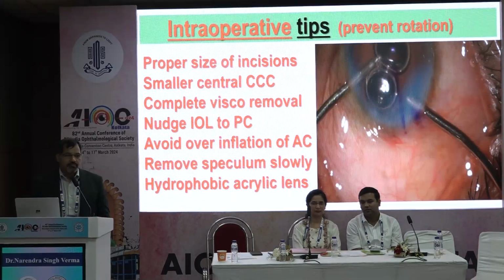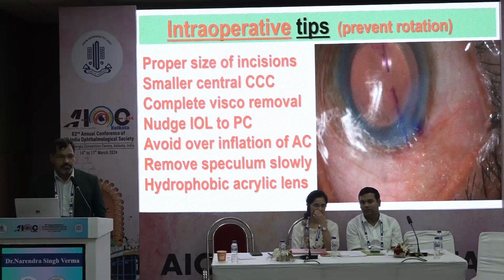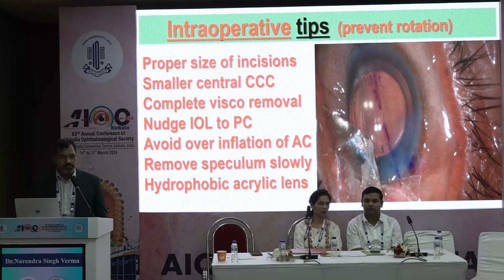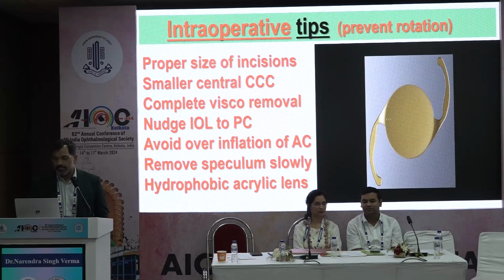After hydration of the wounds, form the anterior chamber with BSS. Avoid overinflation of the AC. Remove the speculum slowly. There should be no pressure on the globe while removing the speculum. Patch the eye for 2-3 hours. Use hydrophobic acrylic lenses as they have high adhesive property.